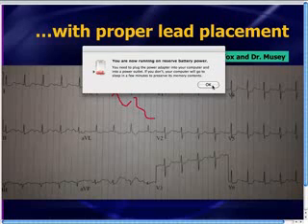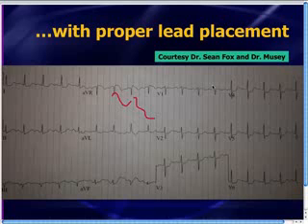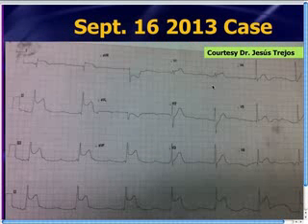Oh, my battery is going to die pretty soon. We'll get done with this quickly. So lead AVR, it may be of concern, but again, the key thing here that I want to point out is you've got to take a look at rightward axis and fix the leads. All right. Now, lead misplacement is pretty easy to miss.